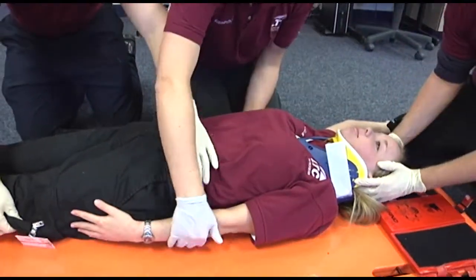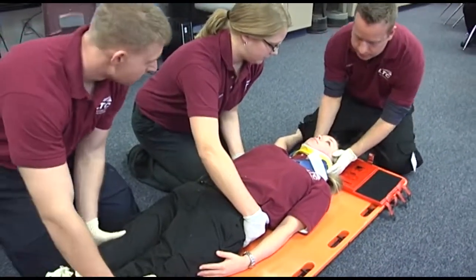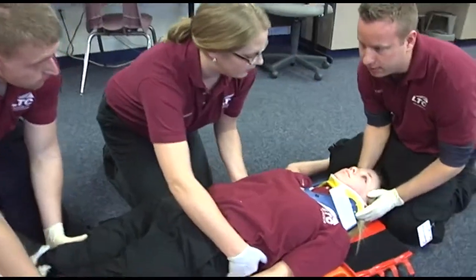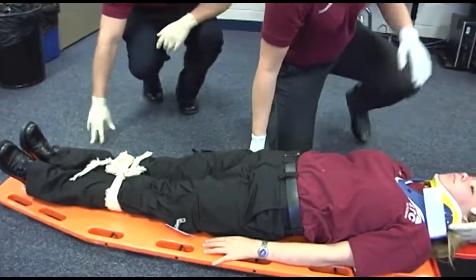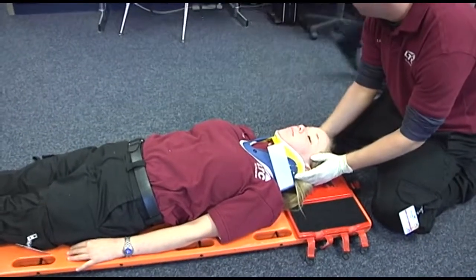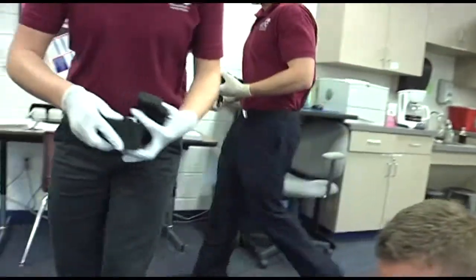It's going to be down and up, or up and down — whatever it's actually going to happen. All right, one, two, three. And down a little bit — one, two, three. Secure the patient — hip side and below the knee.